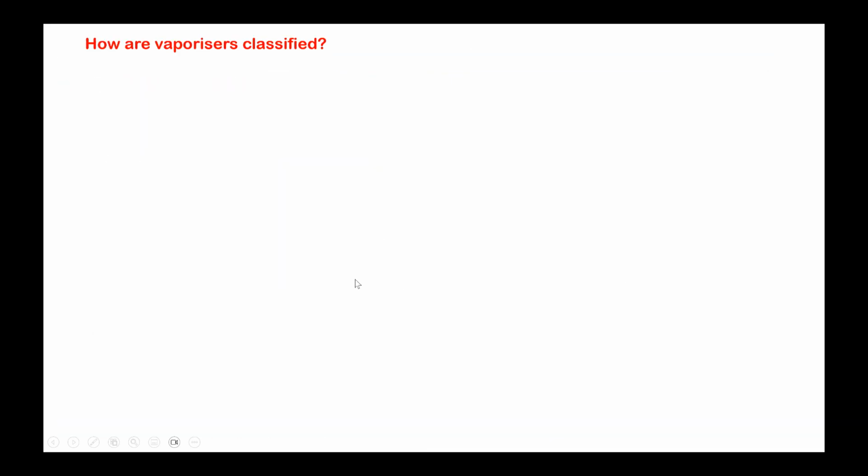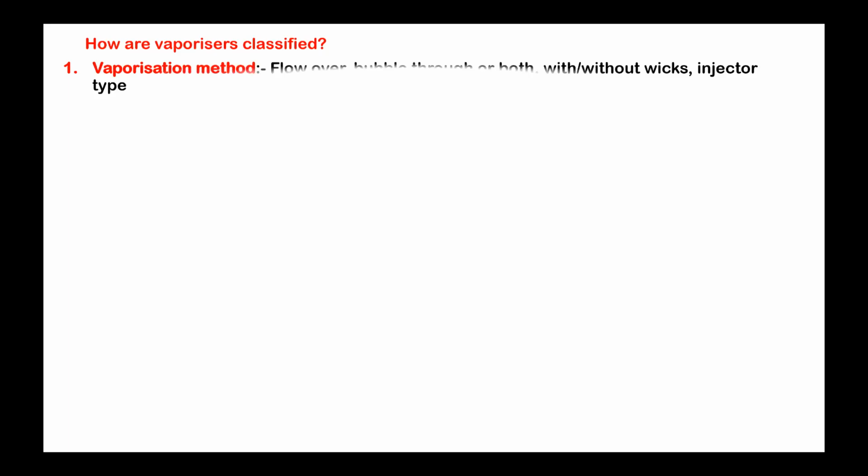So how are vaporizers classified? Any idea? Variable bypass and measured flow vaporizers, measured vaporizers, variable bypass vaporizers. Okay, very good. There are 6 points to be included. One by one I'll tell you.